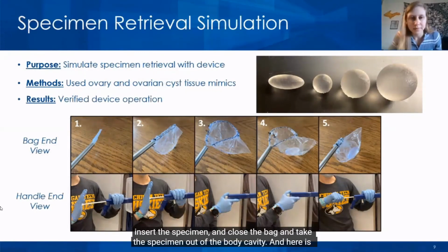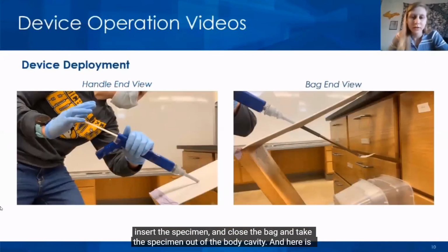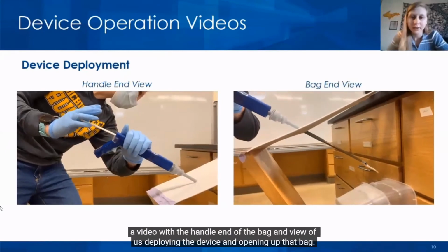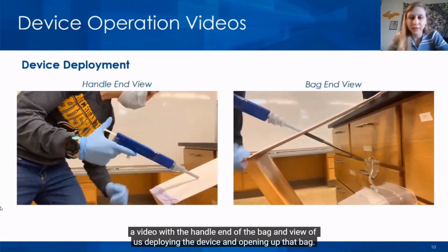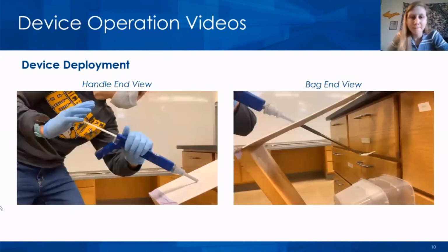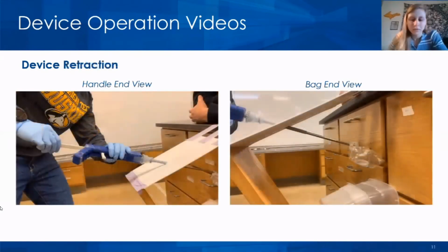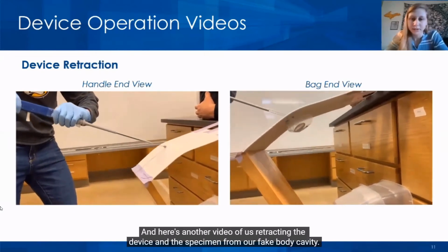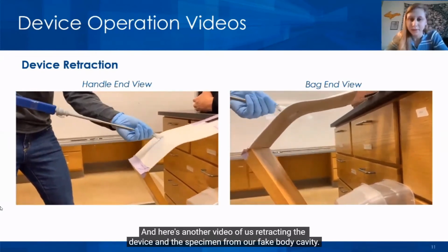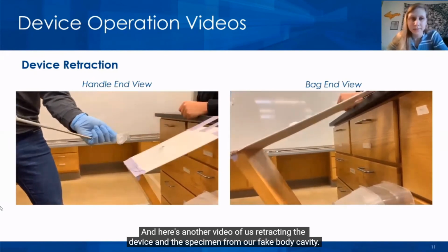And here is a video with the handle end of the bag in view of us deploying the device and opening up that bag. And here's another video of us retracting the device and the specimen from our fake body cavity.